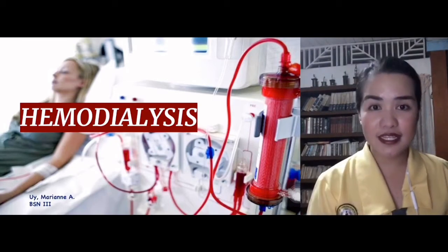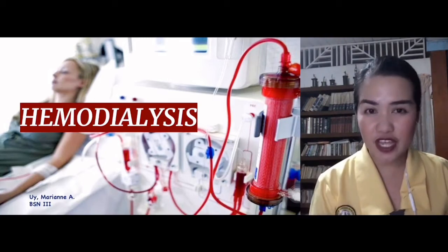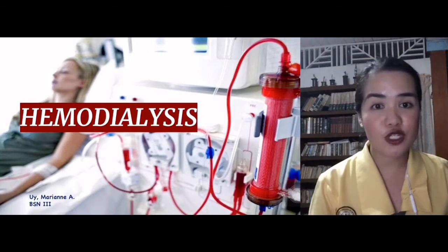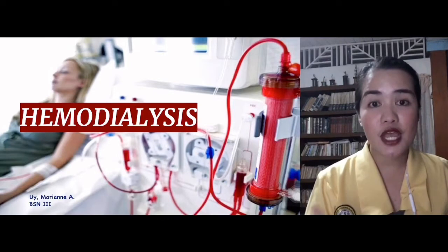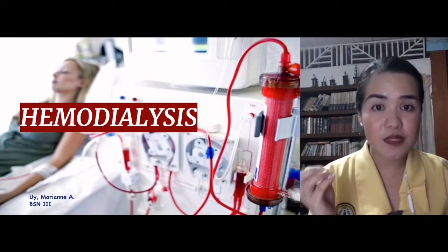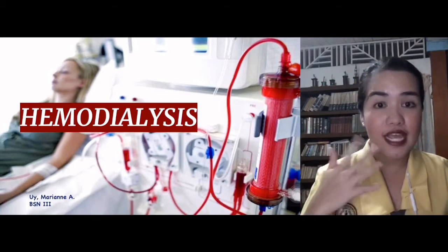Now, dialysis is done for patients with renal diseases, with renal failure or kidney diseases, in which their kidneys are no longer functioning properly or are inadequately functioning, which means their kidneys can no longer excrete the waste products or waste materials that need to be taken out of the body.